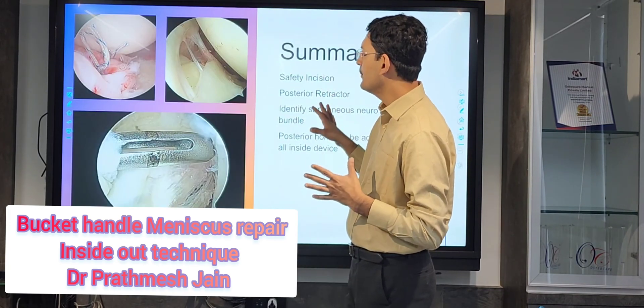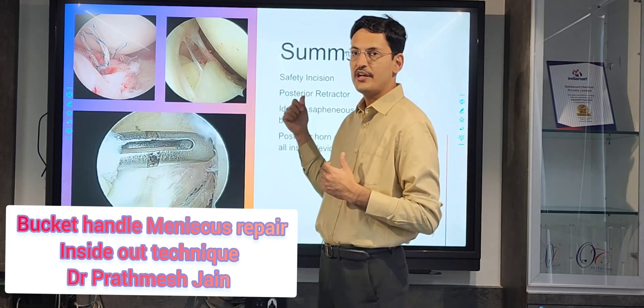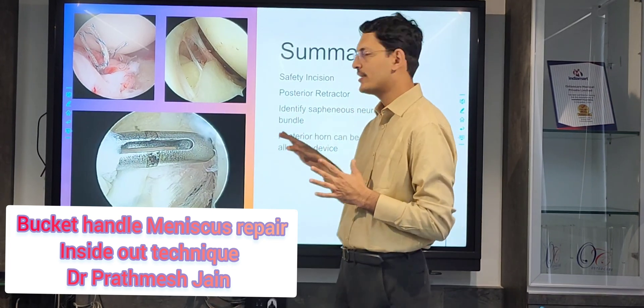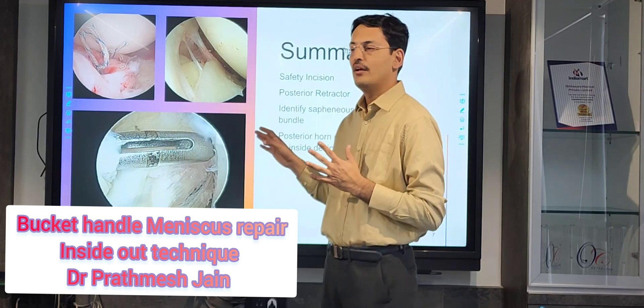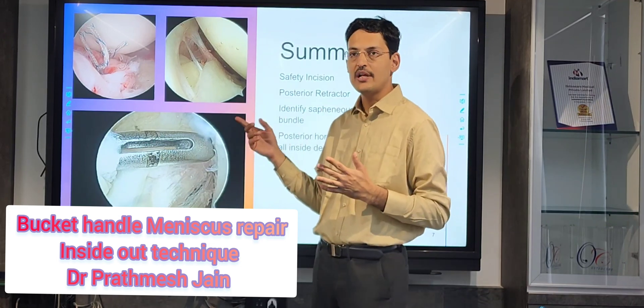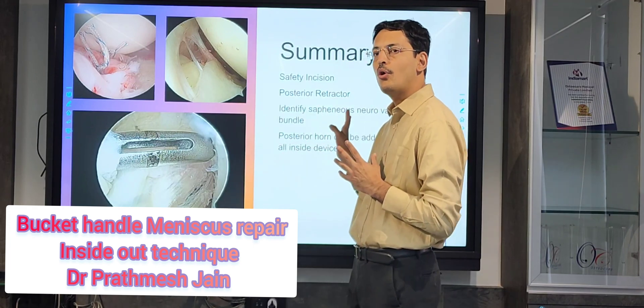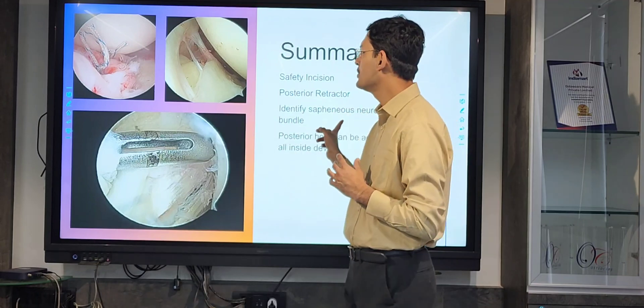In summary: you need to do a safety incision and use a posterior retractor through it. Identify the popliteal neurovascular bundle — the posterior horn can also be addressed well with the inside-out technique. But if you are in doubt, you can use the all-inside technique for the most posterior part of the posterior horn.